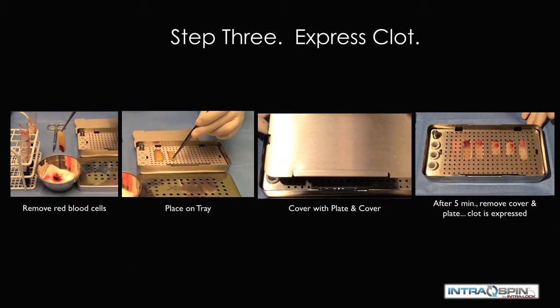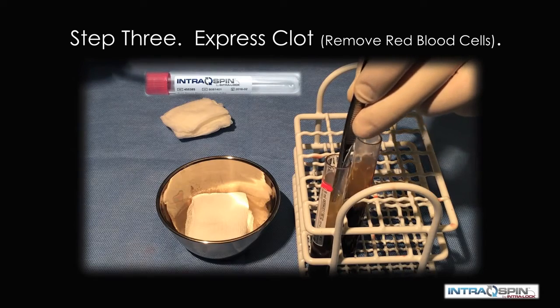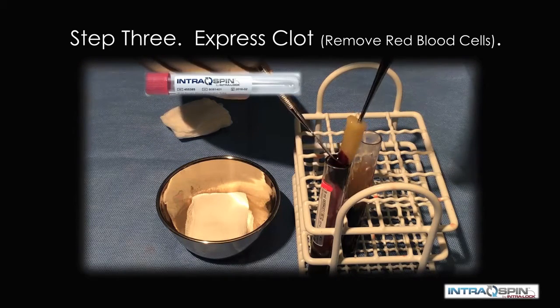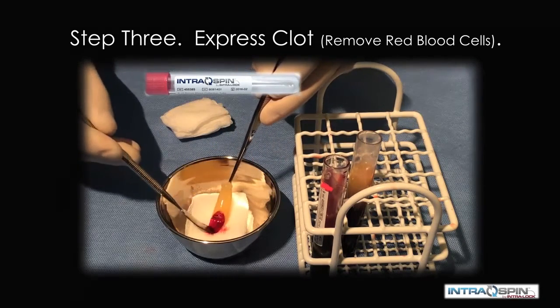The third step is to express the clot. Here we demonstrate the retrieval of the fibrin portion and then the removal of the red blood cell fragment. We exclude the red blood cells because there is no biologic activity.